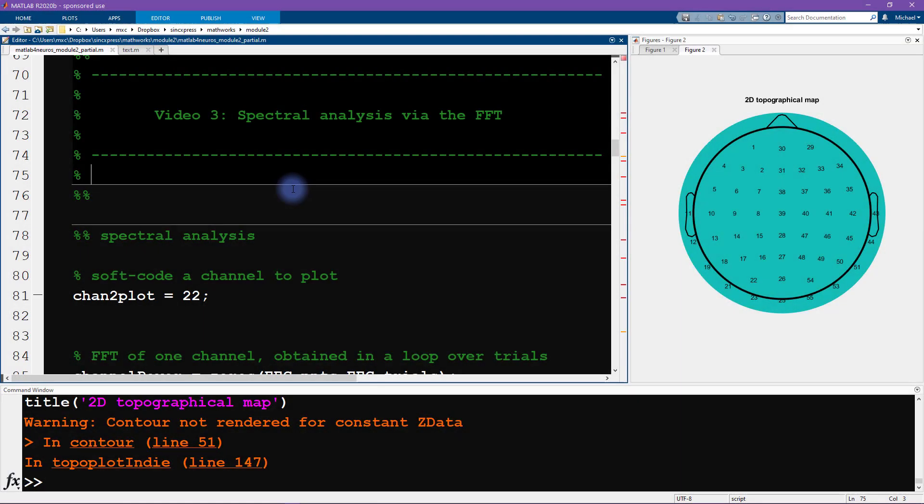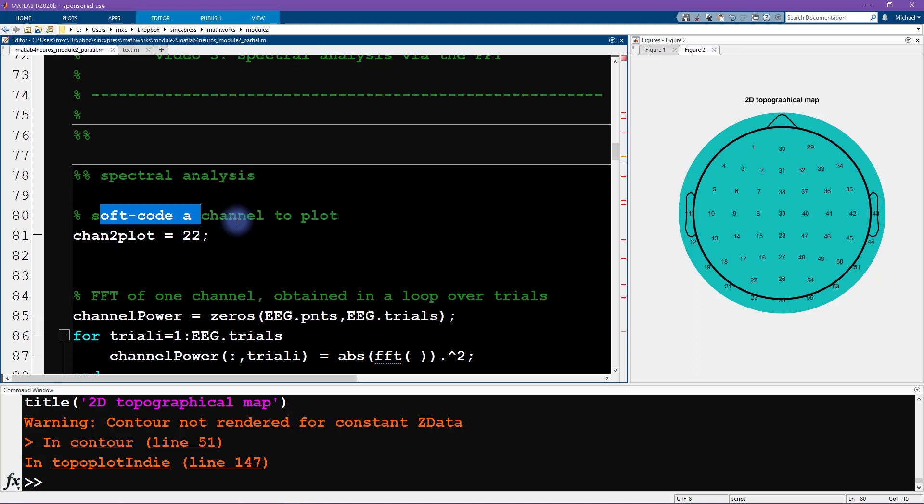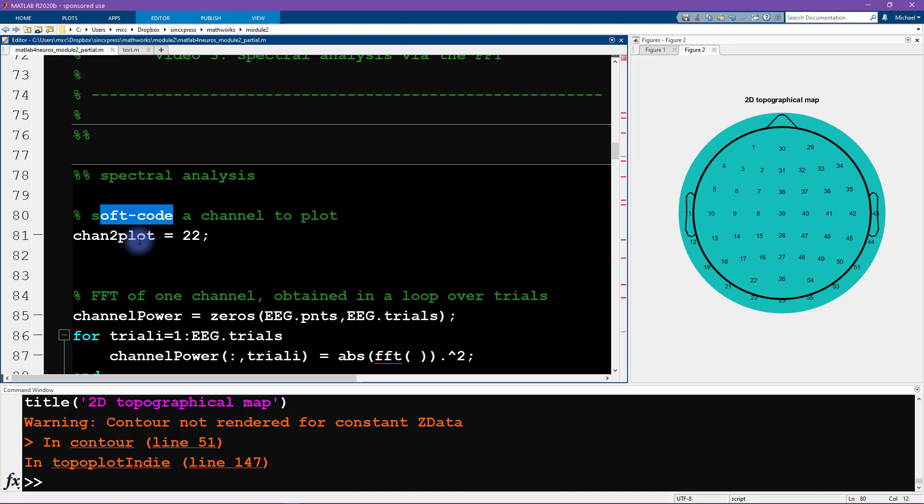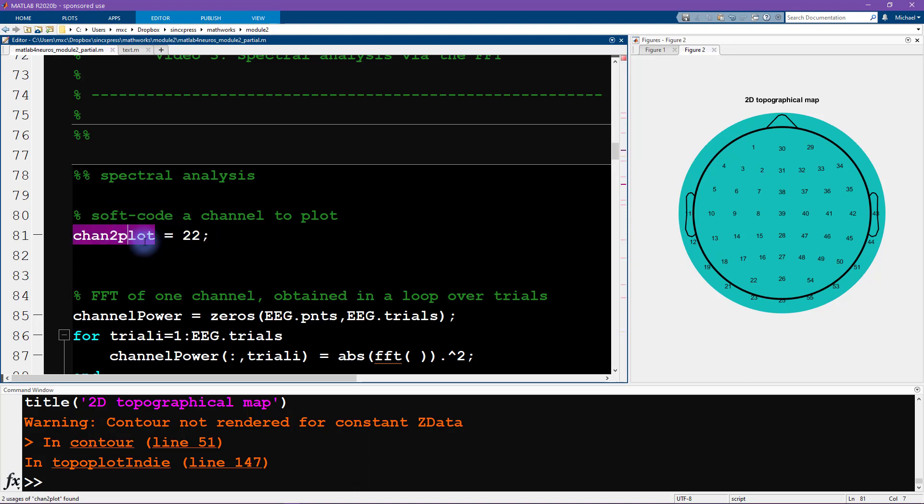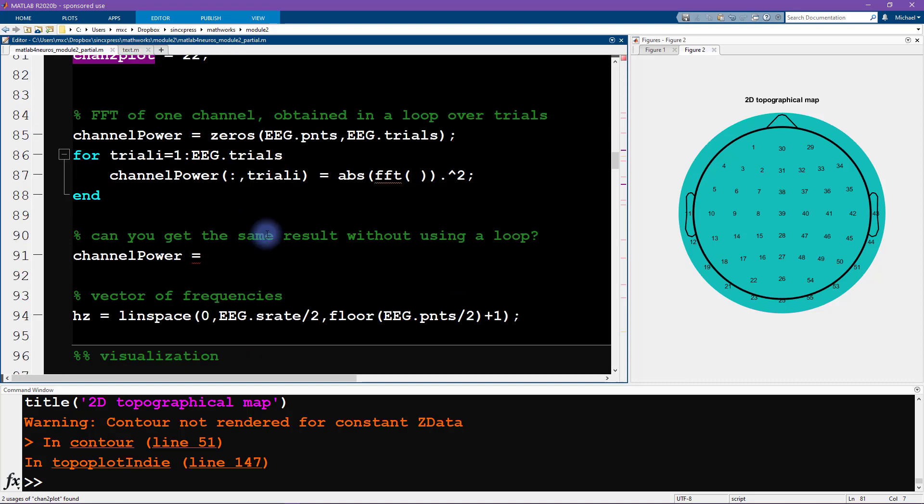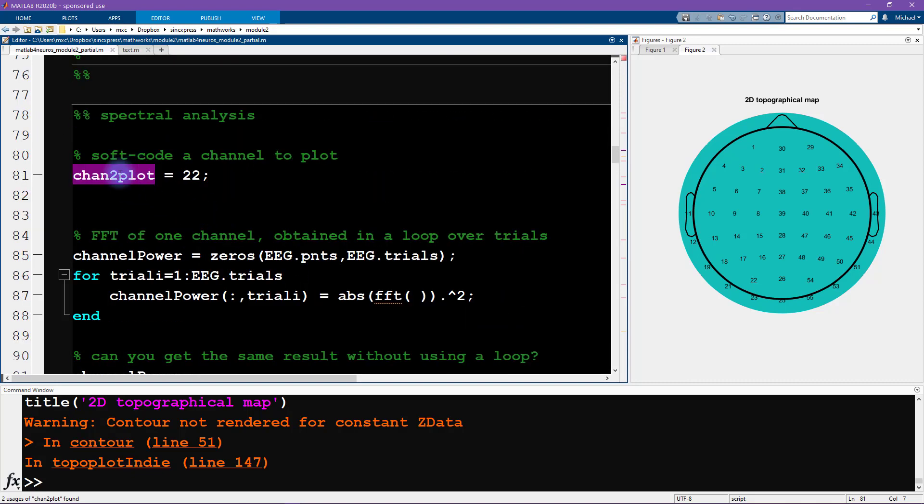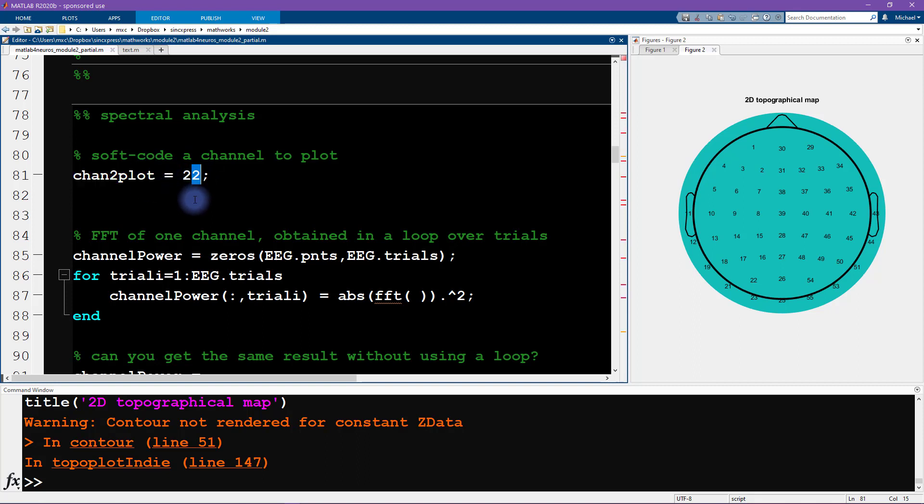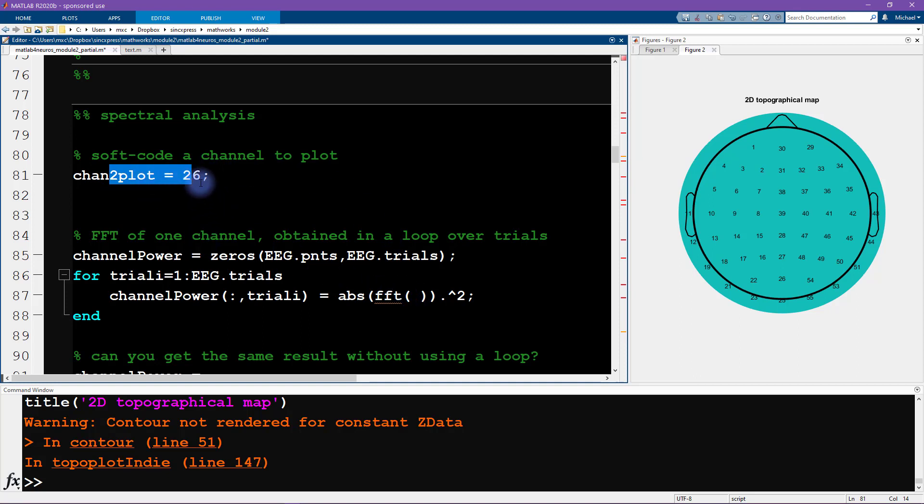We're starting here by soft coding a channel to plot. Soft coding is a term for setting up parameters that you want to run in your analysis at the top of a script, and setting the numerical parameters to be particular variables. This is convenient, because then later on if you want to see what the spectra looks like at channel 26, all you have to do is change this one value here, instead of changing this in multiple places later on. So we're going to work with channel number 22.